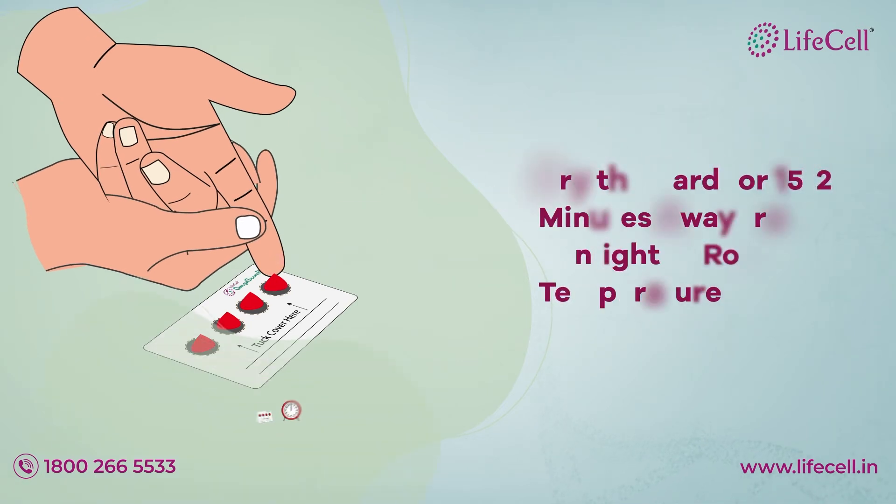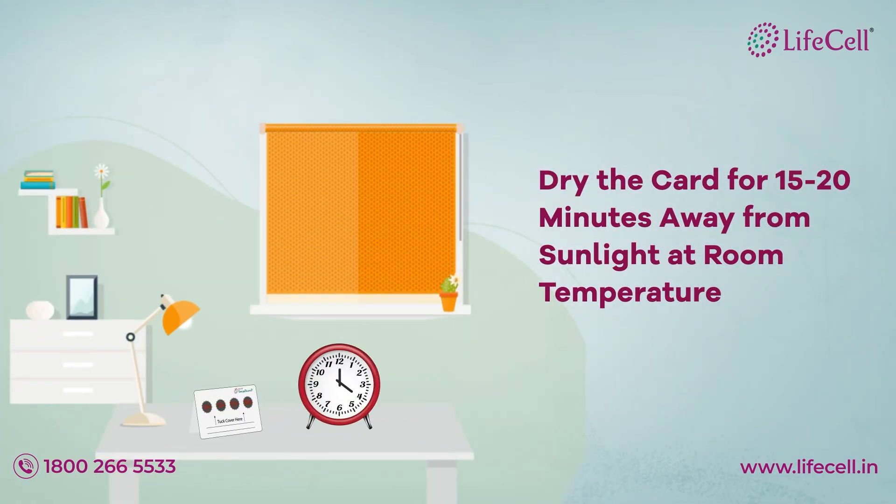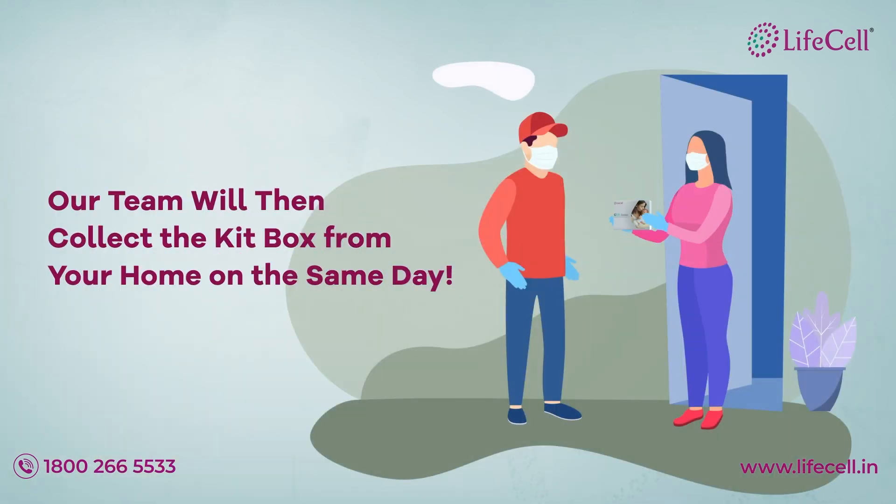Dry the card for 15 to 20 minutes away from sunlight at room temperature. Our team will then collect the card box from your home on the same day.